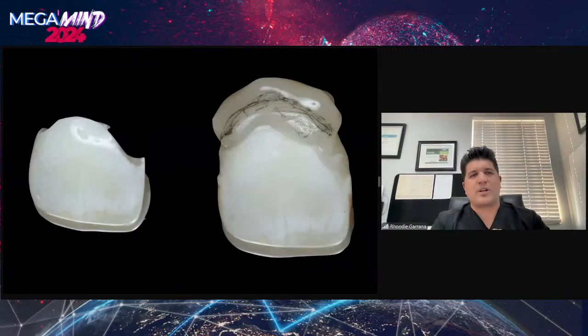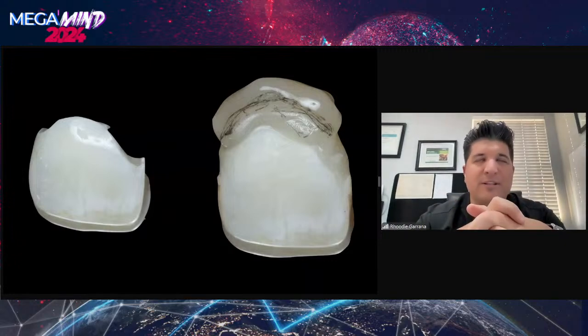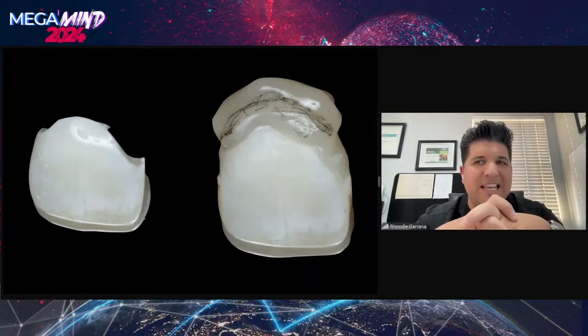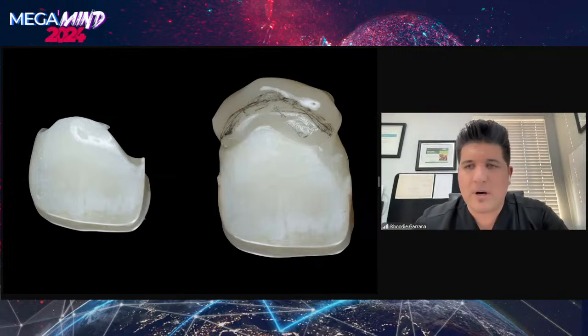The problem was, how do I temporize this patient? Because the benefits of immediate placement and immediate load allows me to preserve the soft tissue architecture and provide some sort of a provisional for the patient during the healing period. In the case where we're not going to be placing immediately, we need some type of a solution that we can give the patient whilst we are awaiting healing.